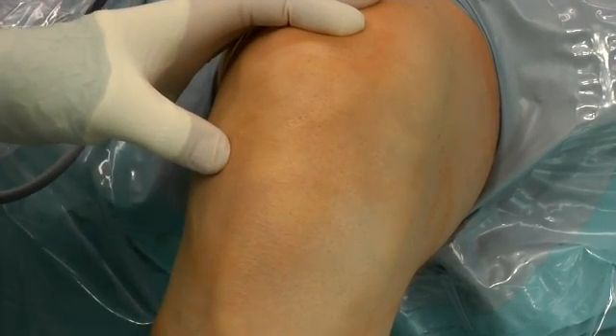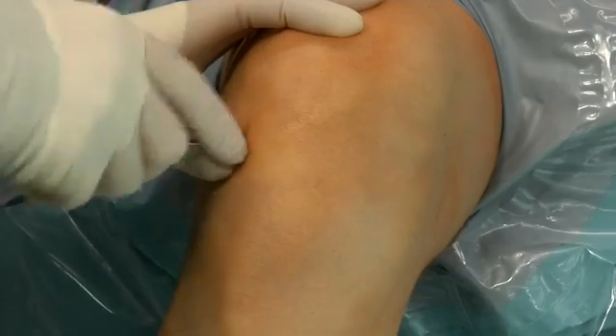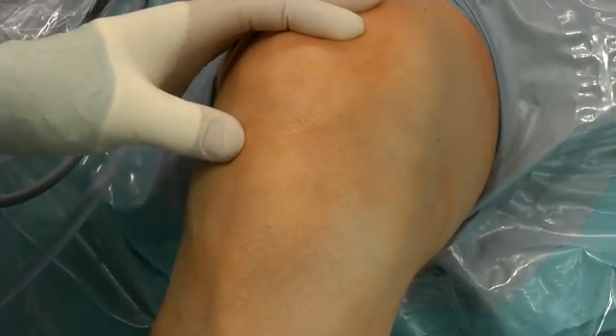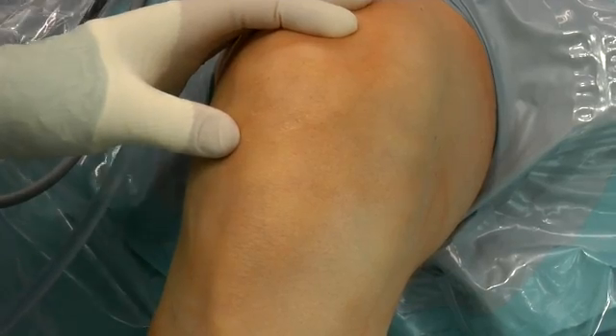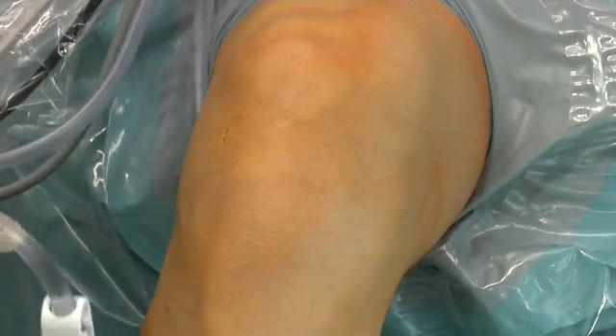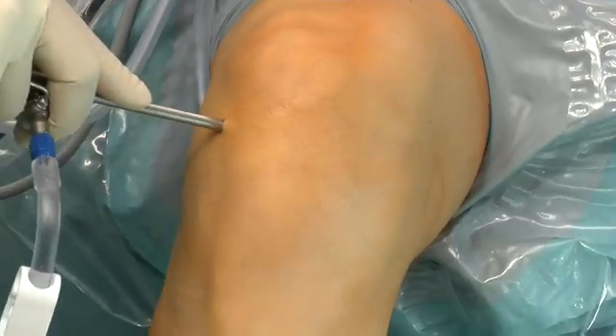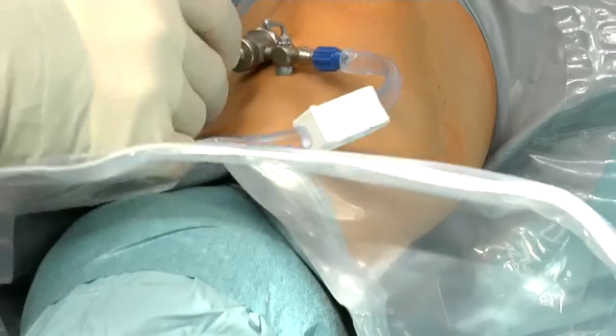I start with arthroscopy in order to confirm the injured ACL. I like to position my anterolateral portal very high and medial, close to the patellar ligament, in order to get good vision to the femoral and tibial insertion site.